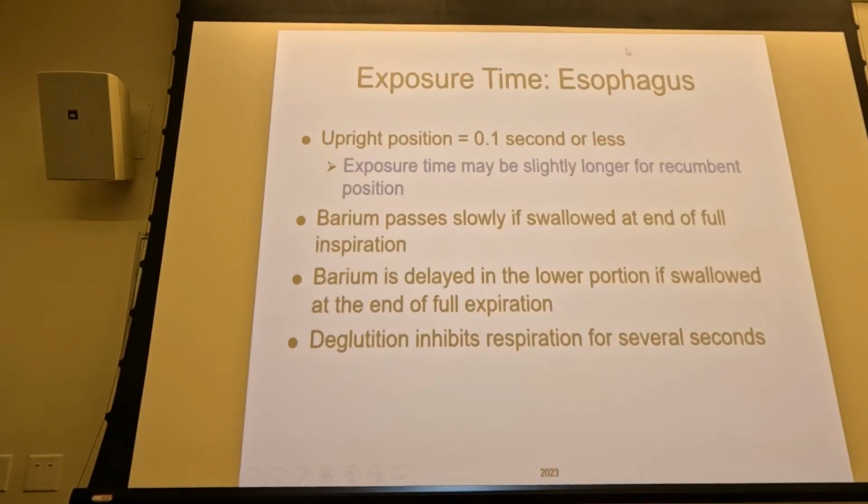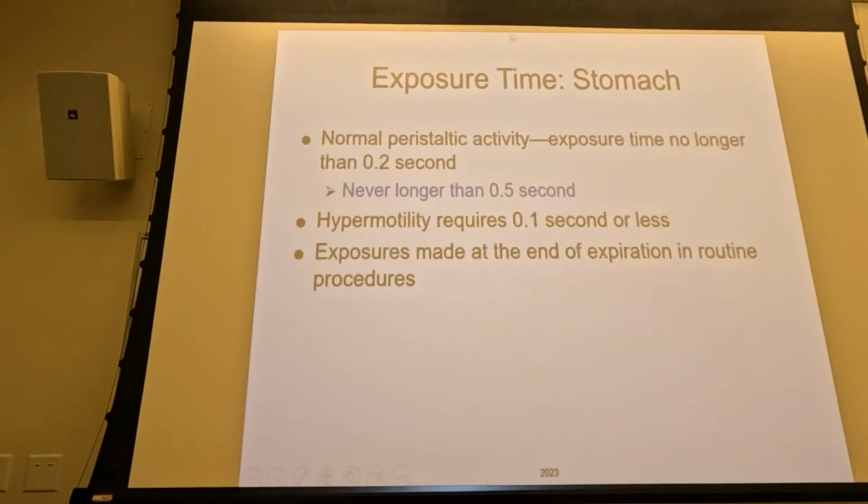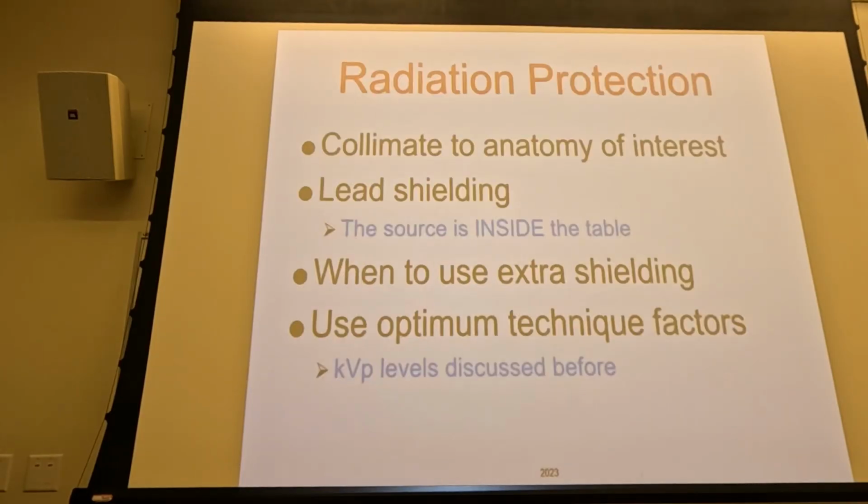All right, so exposure times in the esophagus need to be 1/10 of a second or less. The further it gets into the gastrointestinal system, motion is still an issue, but not as much as it is in the esophagus. All right, so 0.5 seconds.